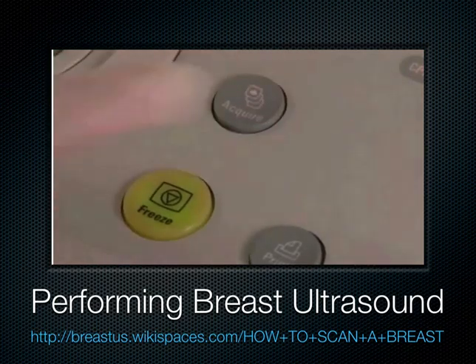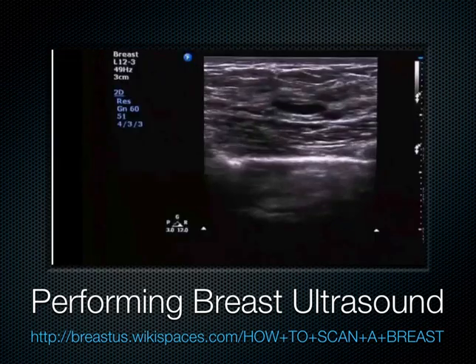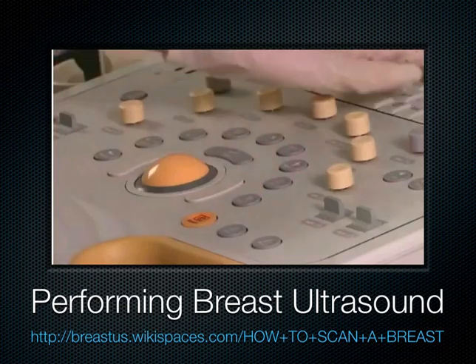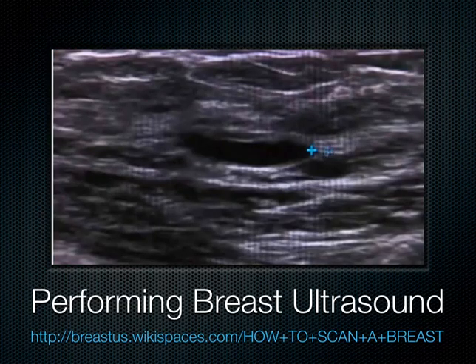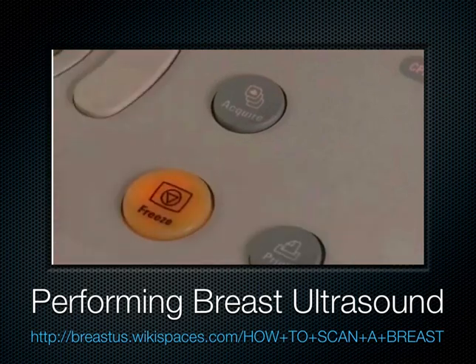Save the image and unfreeze to continue. Rotate the transducer to the transverse plane of the lesion. Freeze and annotate the image. Measure the width of the lesion by placing 2 calipers on the medial and lateral margins. Save the image and unfreeze to continue.